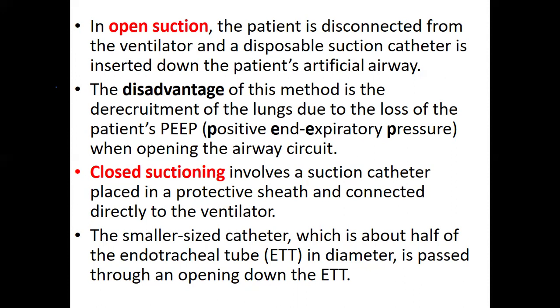The disadvantage of this method is that derecruitment of the lungs will happen due to loss of positive end-expiratory pressure when opening the airway circuit.